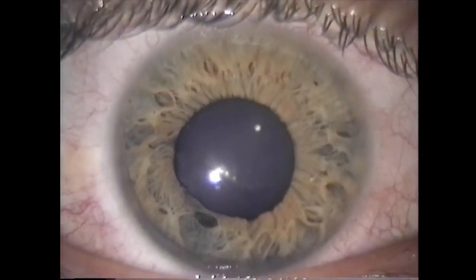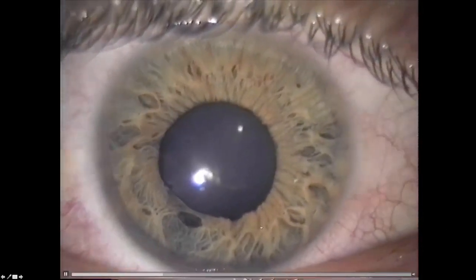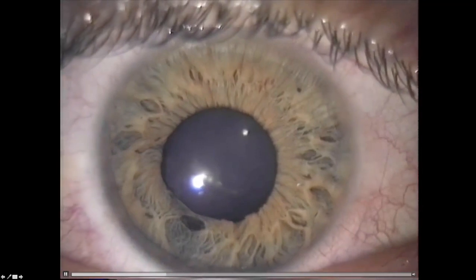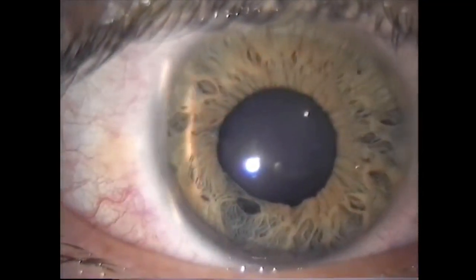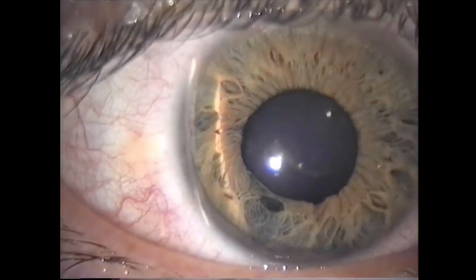This is an eye with angle recession. You can tell it's had trauma because of the defects here in the pupillary sphincter. We make the narrow beam here, measure the corneal thickness like that, and then you can see that this is a very, very deep anterior chamber. Not surprising in angle recession. Just another example here of a very deep anterior chamber.